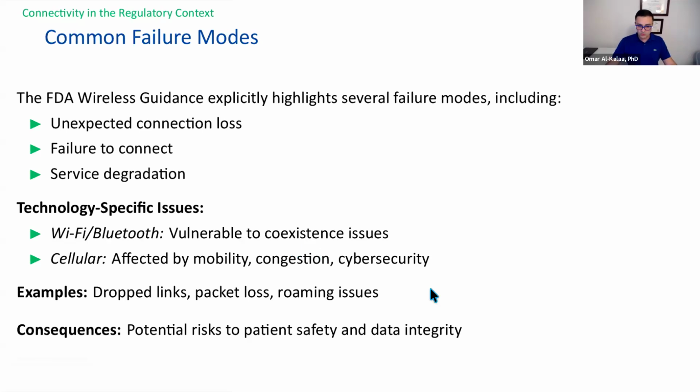The general failure modes of dropped links, packet loss, and roaming issues can lead to serious consequences. These can give rise to risks to patient safety and data integrity. So even though they are sometimes taken for granted, like, hey, I just established my network link and I'm good to go, I should start to worry about what goes on that link. The link itself is vital for your connected medical system if your device function depends on that network link. So you should pay close attention to how that link is constructed, how it is established, and how it's tested.